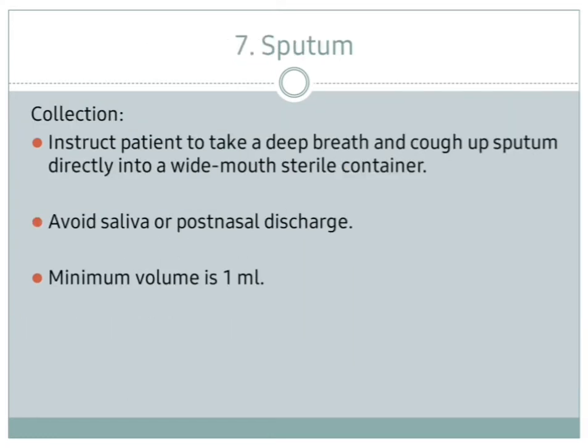Sputum. Here we have to instruct the patient to take a deep breath first and then cough up the sputum into a wide mouth sterile container. We want a clear sputum, only sputum, without saliva or postnasal discharge, and the minimum volume is 1 ml.